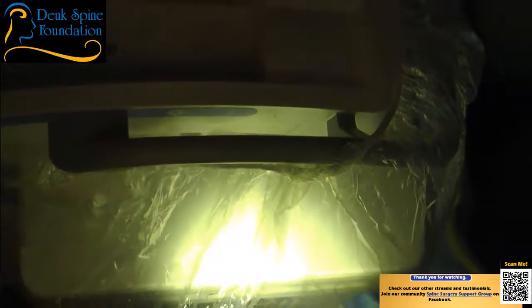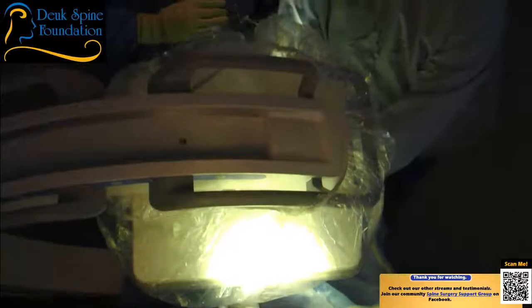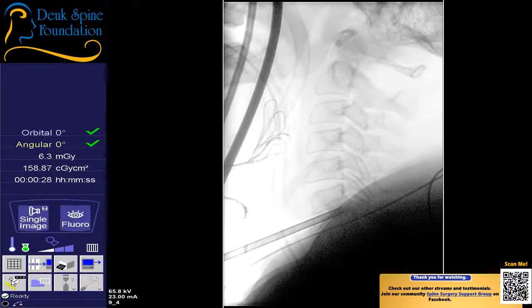So we've taken the herniation out at C6-7. Next is going to be the 5-6 herniation. It's not as big. Here's some herniation, by the way, if you want to add it to your collection. Let's go. Wait, go back down again for just a second. I want to drain the bag. That should be good. Thank you. That's good.